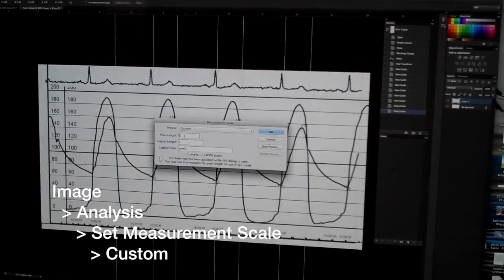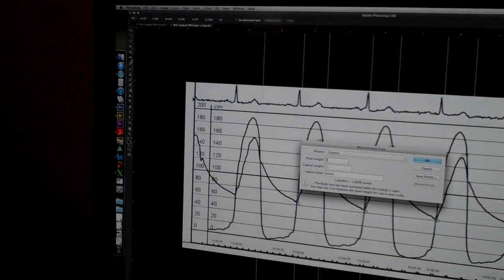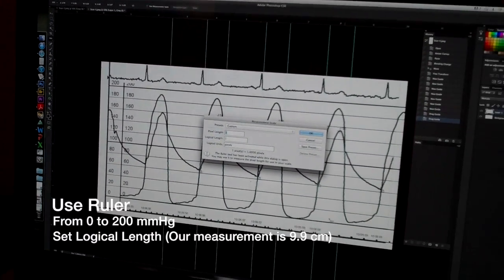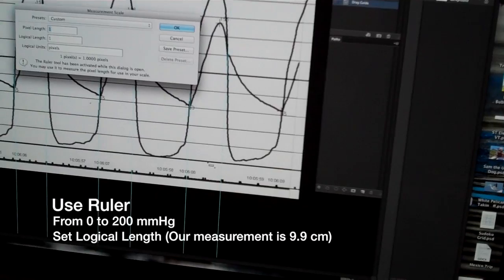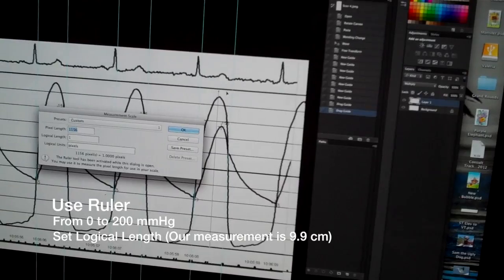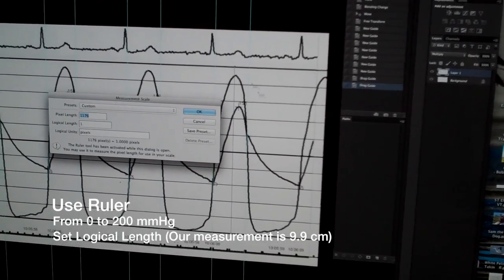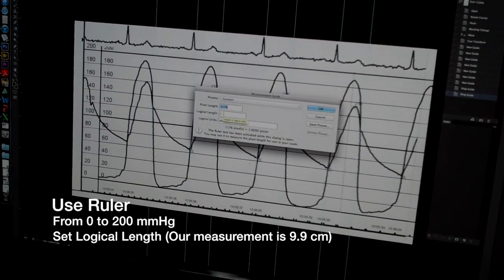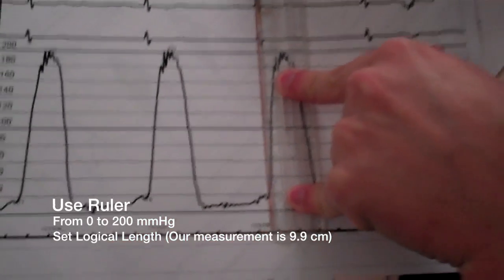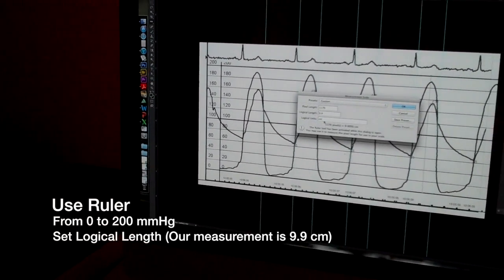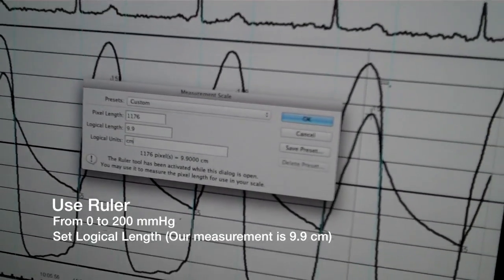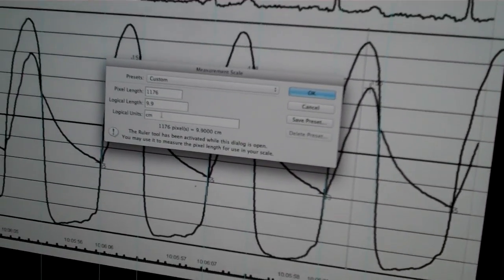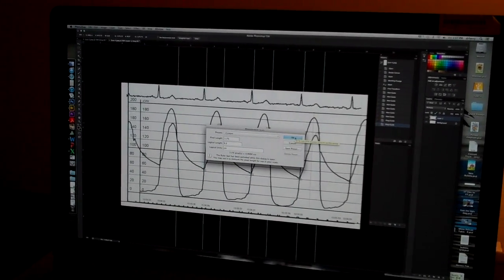And I'm going to enter that into the measurement package. It's found in CS6 here under Image, Analysis, Set Measurement Scale, Custom. And the pixel length is not what I'm going to set. I'm going to go over here and this defaults to the ruler tool now on the toolbar. And so I'm going to start here at the top of the zero line and hold the shift key down so this is a straight line. And I'm going to go up to the top of the 200 mark like that and let go. So that says that's 1176 pixels on the screen. Now according to the measurement on the paper that was 9.9 centimeters.